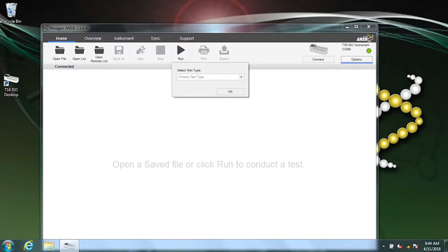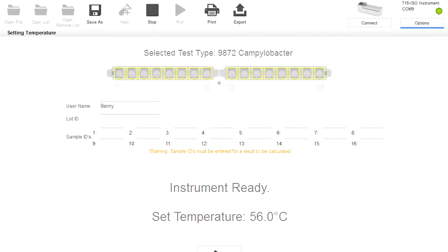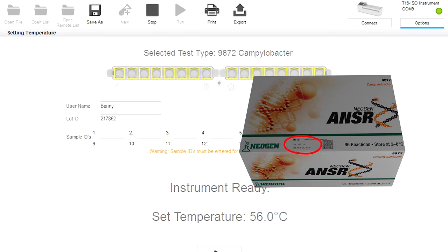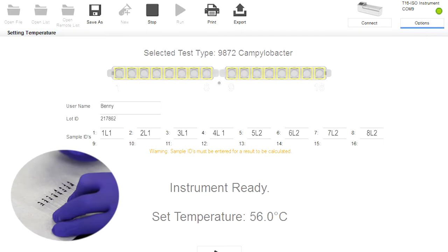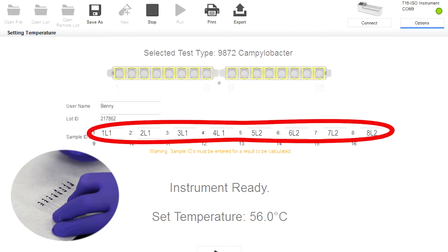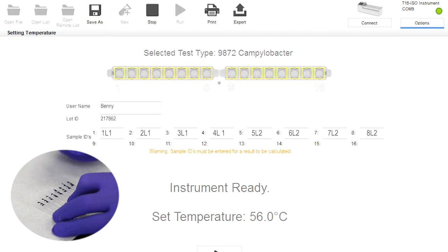Remove your gloves and from the computer, select Run. Select 9872 Campylobacter from the Test Type drop-down menu, then click OK. Fill in the username and lot ID from the kit and corresponding labels from your samples in the sample IDs. These should match the cluster tubes as well. If you do not put in a sample ID next to the well number, the reader won't read it even if it has a sample. Be sure to provide an ID for every well you're running. In this case, we are only running 8 samples, so wells 9 through 16 are empty.